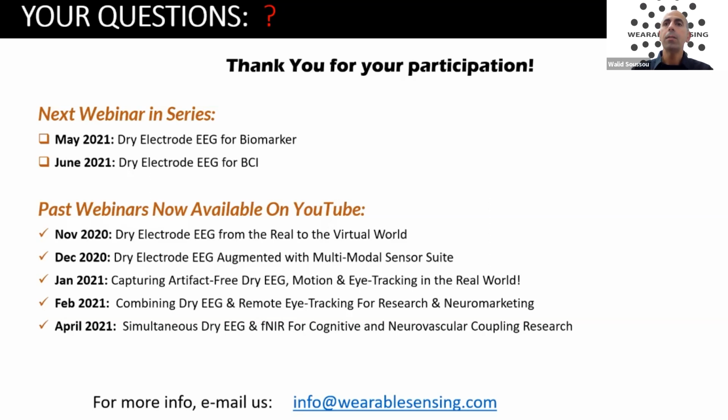And so again, this is only possible because we have the ultra-high impedance amplifiers right at the source, and we have the Faraday cage shielding the sensors from the pickup of environmental artifacts. So we can do it because of a lot of mitigations that were put in place and a lot of custom circuitry that allows us to do this.